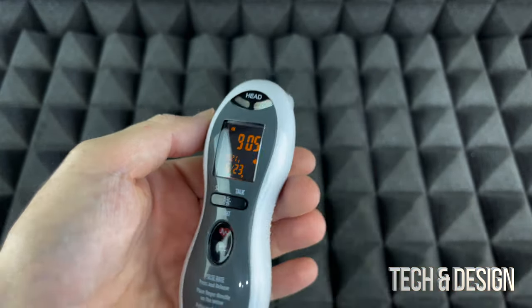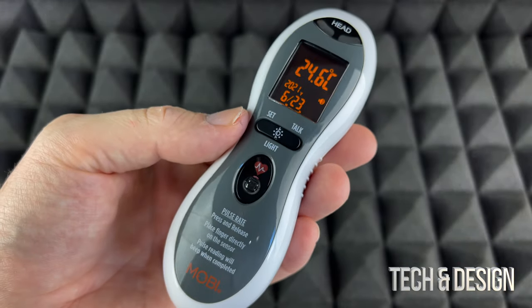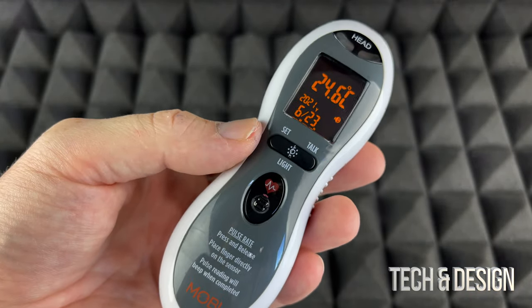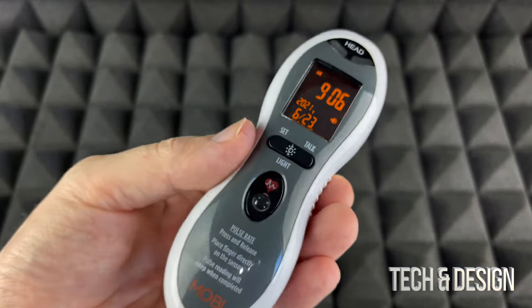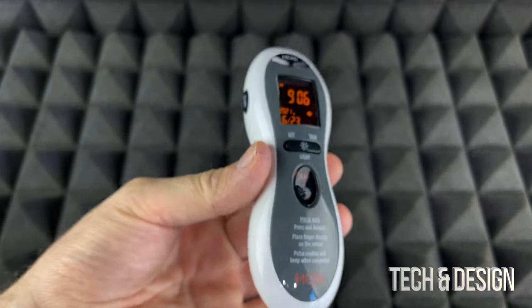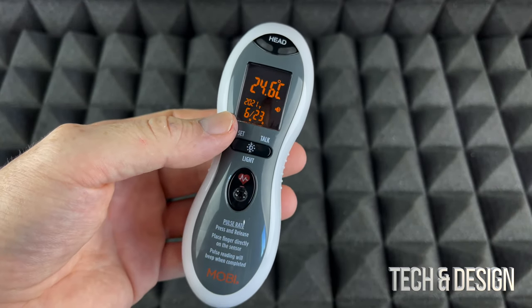This device should be stored in the same bedroom where you're going to take somebody's temperature for at least 30 minutes. So before you take somebody's temperature, just place this in the same bedroom for 30 minutes.